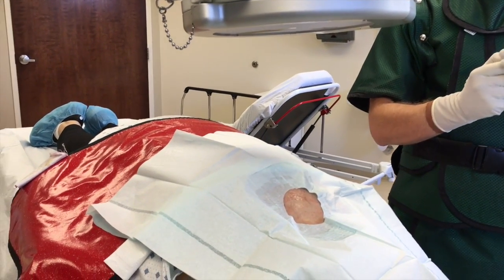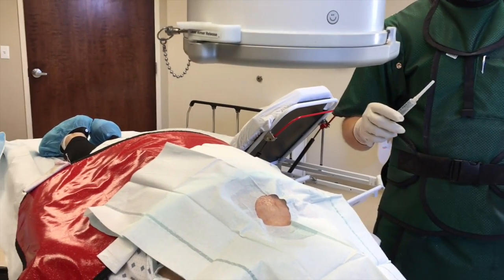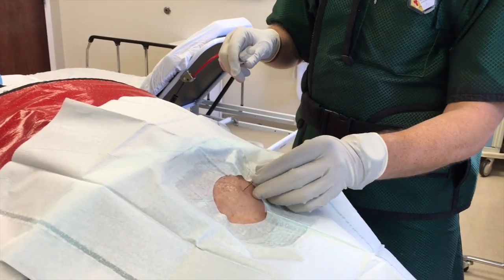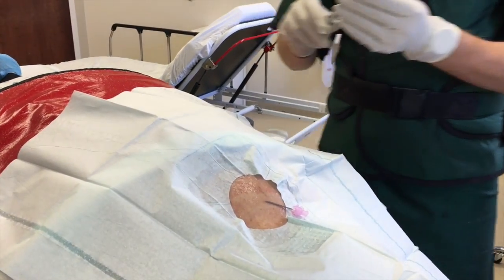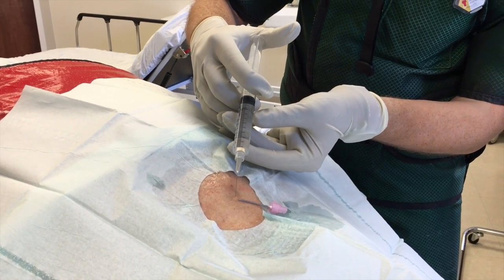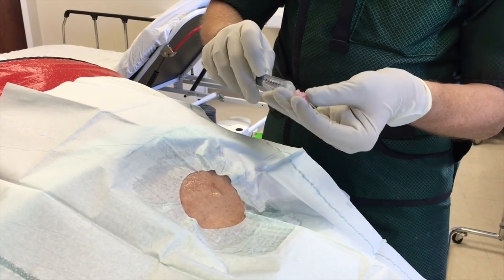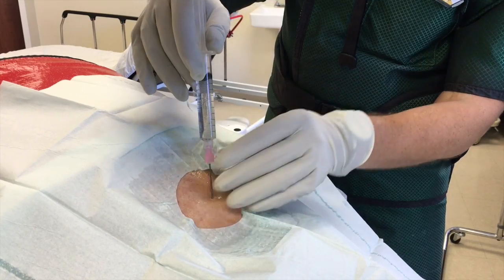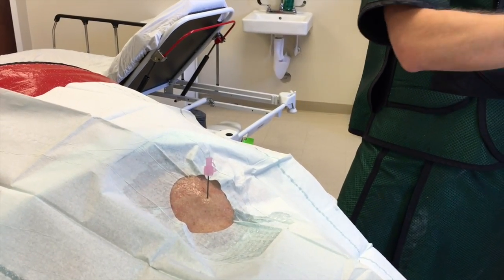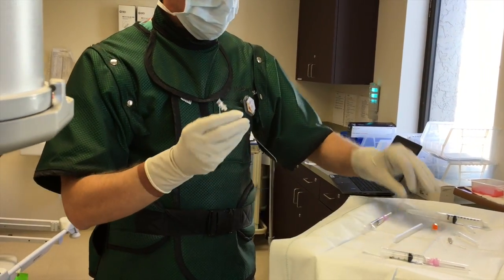Which increases the safety immeasurably. So what we're gonna do is take a little mark, swivel north, right onto the top of this spot. We're gonna have a little cold spritz. Mrs. L, talk to me, make sure we're doing okay. I don't feel cold. Okay, it's coming at you — a little cold spritz. And then we're gonna make just a little tiny pinch with the lidocaine there. It just makes everything comfortable. You okay? I'm perfect. And since the little blunt needle is more like a pencil — it doesn't have a cutting tip, it won't go through the skin — it's so blunt, so we have to make a little tiny portal. And then we put a little tiny bend, because we want to be able to steer this little rascal. It's super thin, that's the way to do it. Thin is in.